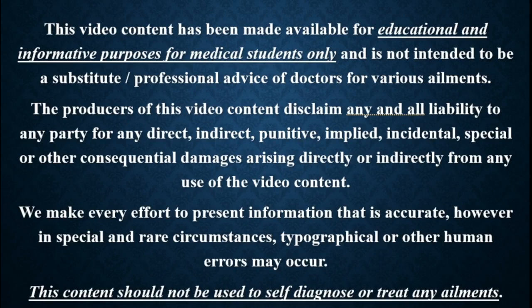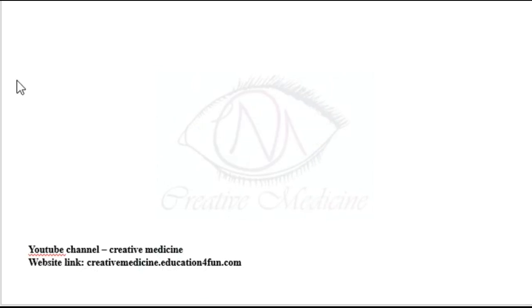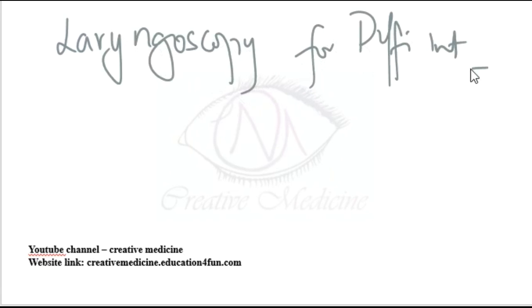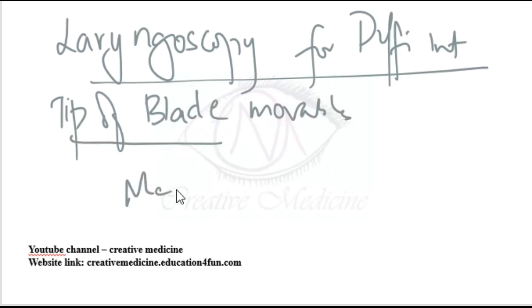In this lecture, we will learn about the laryngoscopes used if there is very difficult intubation. One, McCoy laryngoscope. In McCoy laryngoscope, the tip of the blade is movable. It can be used for difficult intubation. Second, external manipulation of the larynx. The tip of the blade is actually movable in McCoy laryngoscope.